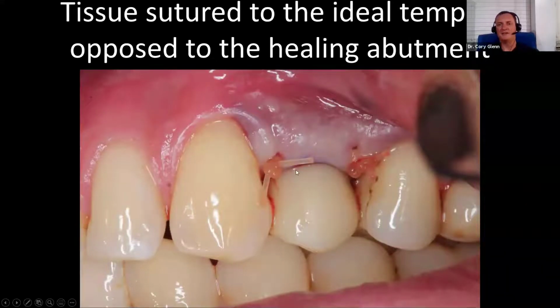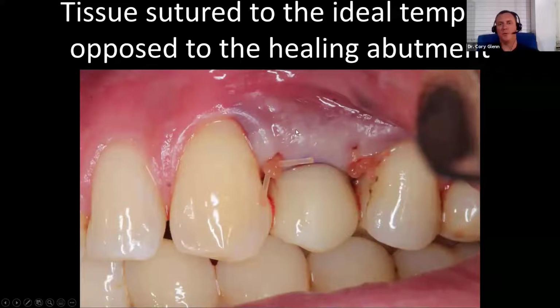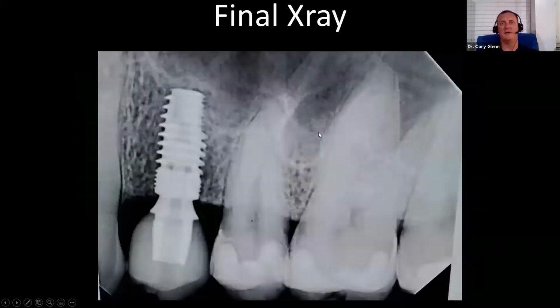Okay, that's how he was sutured up. Again, if you have any problem, it's going to be that the tissue doesn't die back enough to match these adjacent teeth. You get a tremendous amount of attached gingiva when you do things this way, because everything in that gap, since we're not getting primary closure, is going to fill in and create keratinized gingiva. And again, the only thing that could go south is that this won't recede enough. It will recede a little bit during healing, but I've actually had some cases where I had to go back and trim that tissue down a little bit.